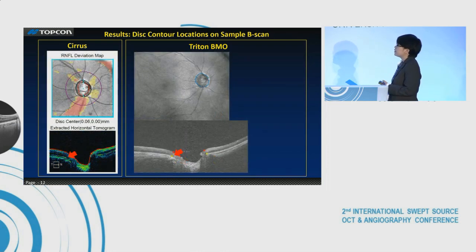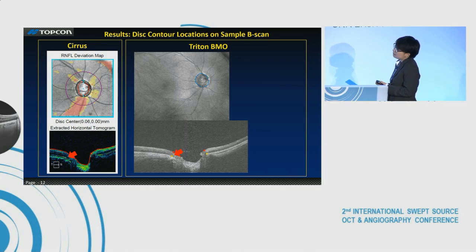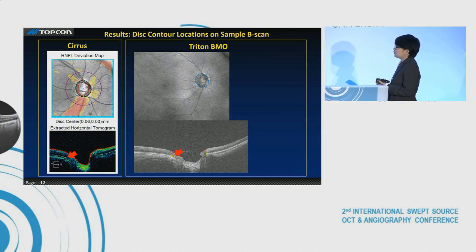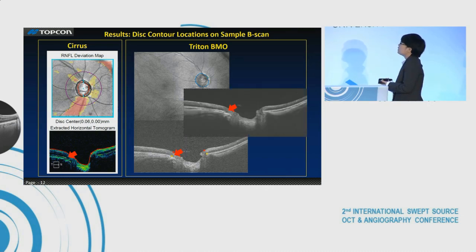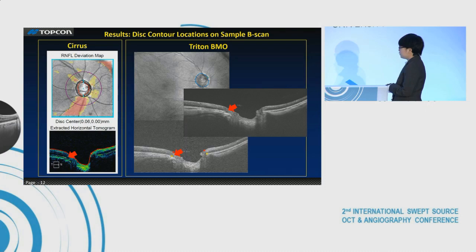Here is another example. Again, Cirrus detects one point, and Triton detects a different corresponding point. The radial scan with higher resolution further illustrates these differences.